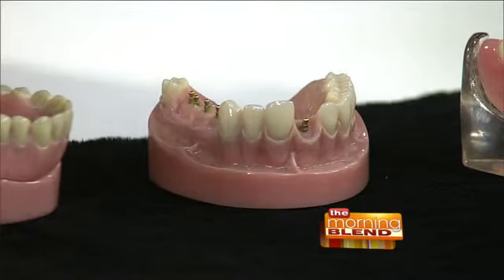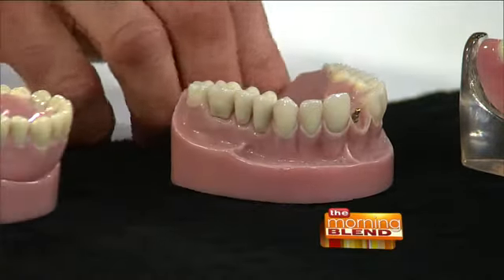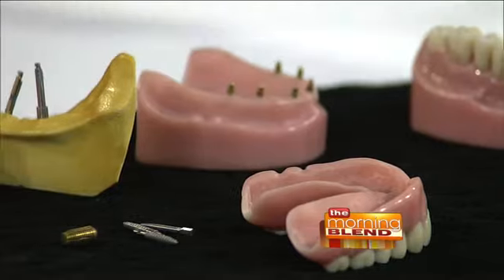Do you take them in and out yourself then? They can. But if they're missing a tooth and they decide they want a fixed tooth, or if they're missing several teeth and they'd like to have that cemented in, then we will make a prosthesis and put cement on it and cement it into the mouth, and then it won't come out. So that's better if you have some existing teeth, right, and you want to fill in? That's the way we usually do it, but if people are missing all of their teeth, we can put in more of the dental implants, and then we can get rid of all the pink and cement a roundhouse, as we call it, all 12 teeth.